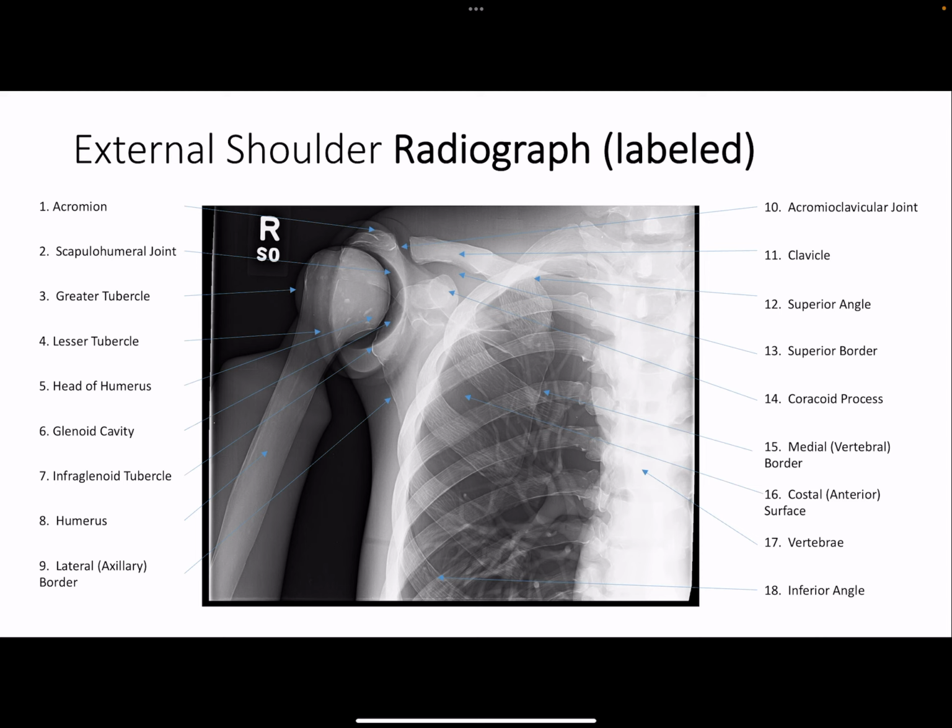Pathology best demonstrated and clinical indications of this image are fractures or dislocations of the proximal humerus and shoulder girdle, and calcium deposits in muscles, tendons, or bursal structures. Degenerative conditions, including osteoporosis and osteoarthritis, can all be seen in this projection.